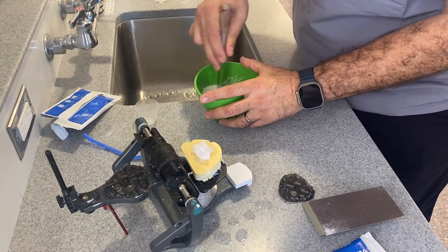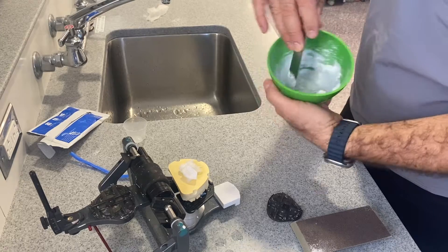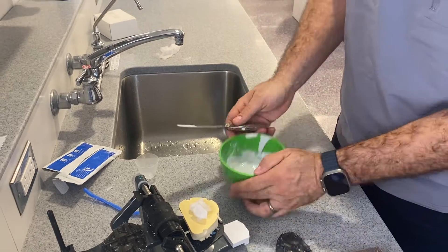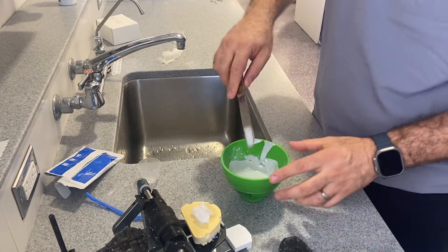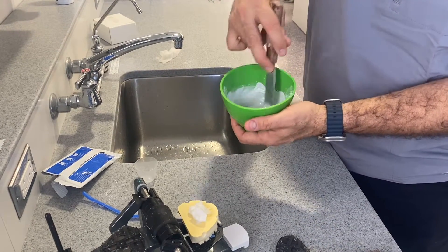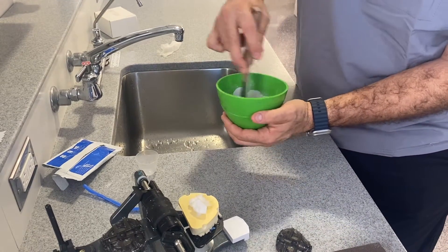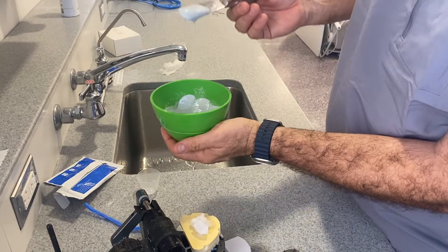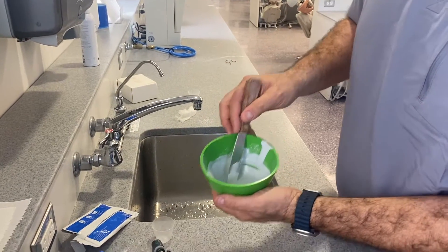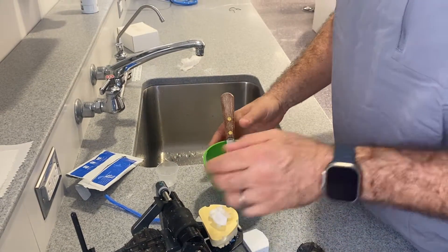Add it and mix it. We want to use the thin spatula and we're going to use the clear green bowl. The dark green bowl and the thicker spatula are only and exclusively used for alginate. You're going to get a mixture — this mixture is a little runny still, so you still have time. Don't try to apply it right now because everything is just going to start falling all over the place.